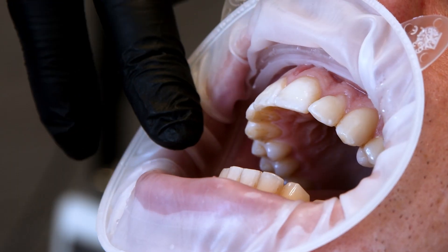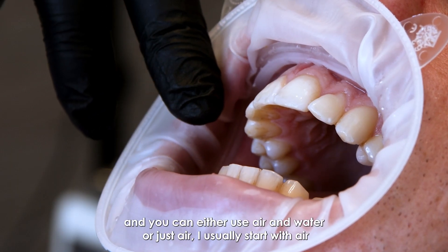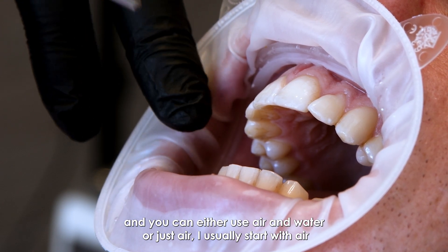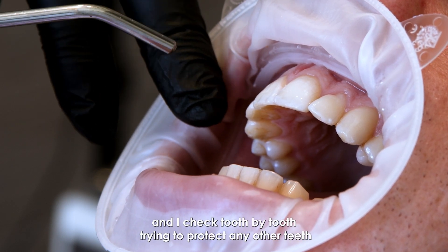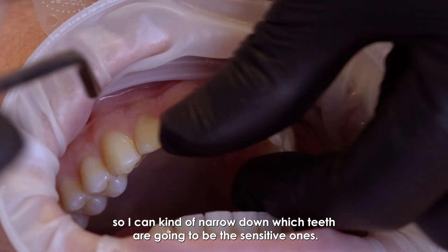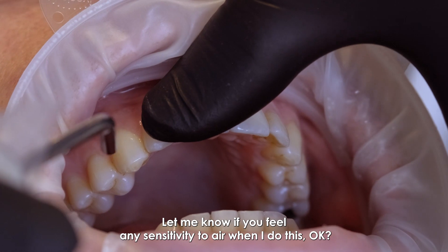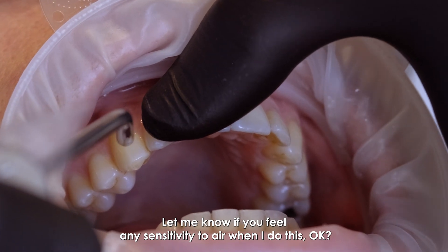First, identify the teeth that are sensitive — you can use air and water, or just air. I usually start with air and check tooth by tooth, trying to protect any other teeth, so I can narrow down which ones are going to be the sensitive ones.